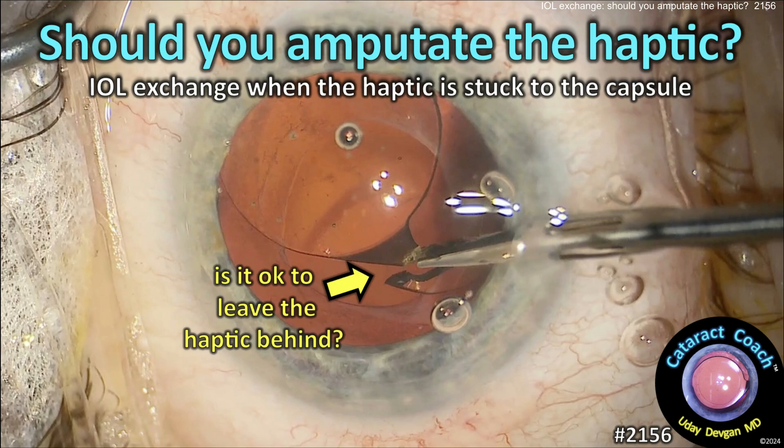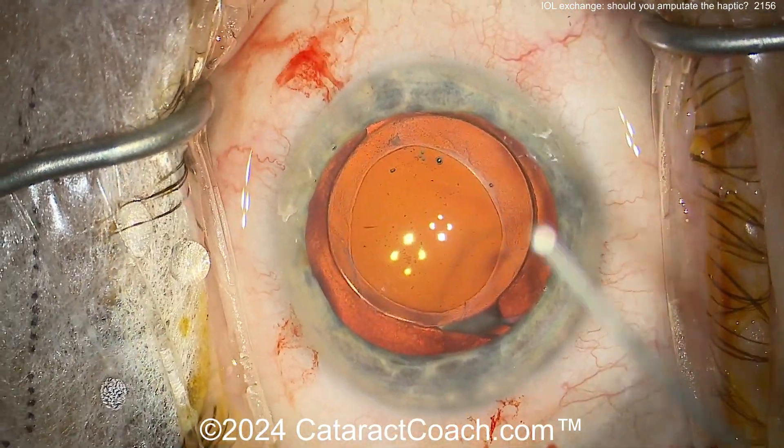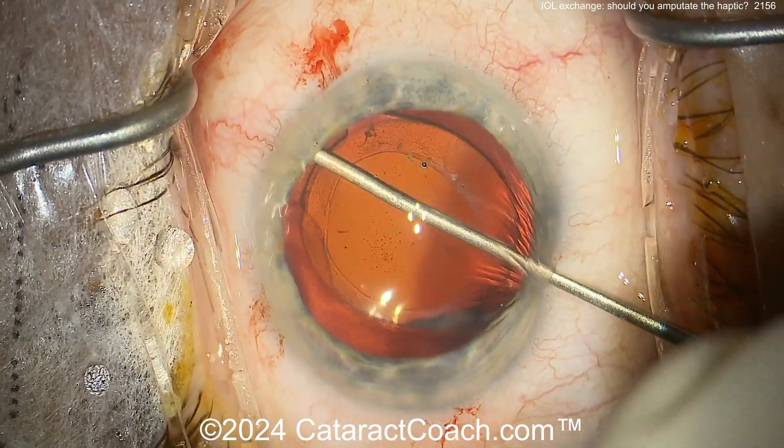CataractCoach.com. Should you amputate the haptic when you're trying to do an IOL exchange and it seems like it's just stuck to the capsule? Let's watch a case here. This patient had cataract surgery done previously and for whatever reason an IOL exchange has to be done.